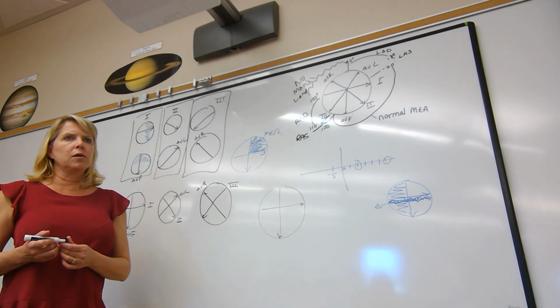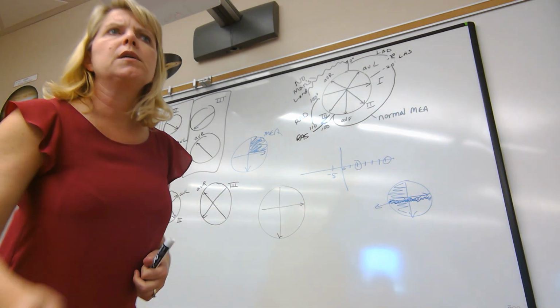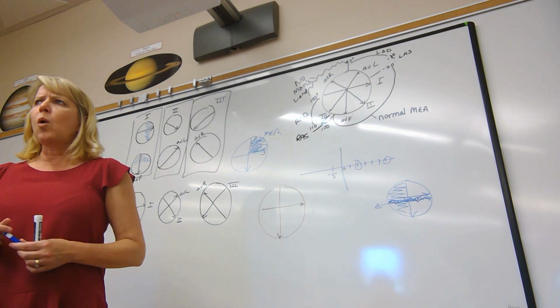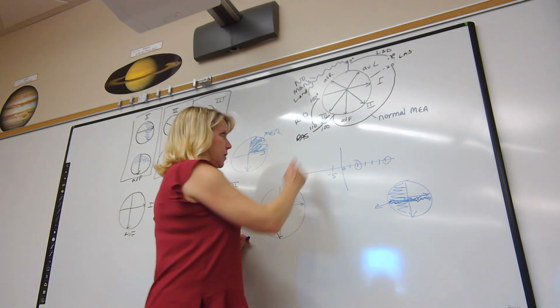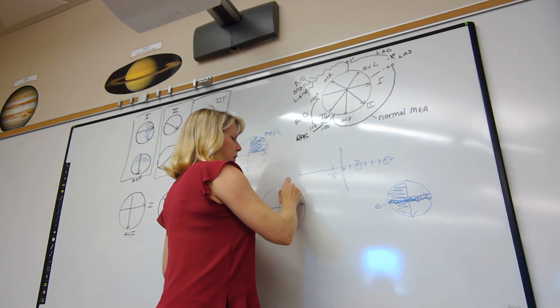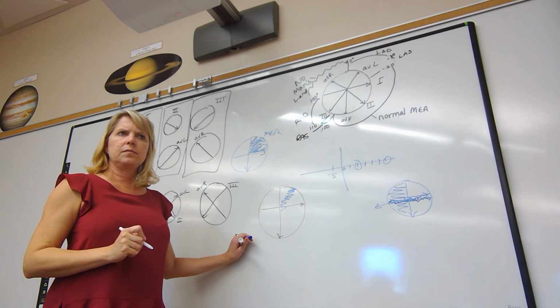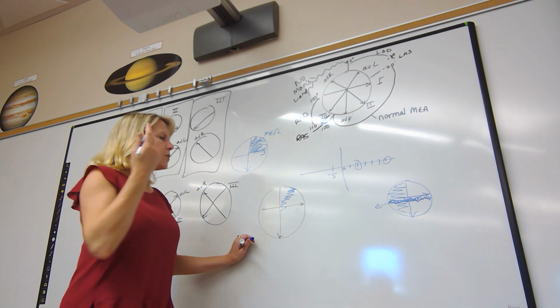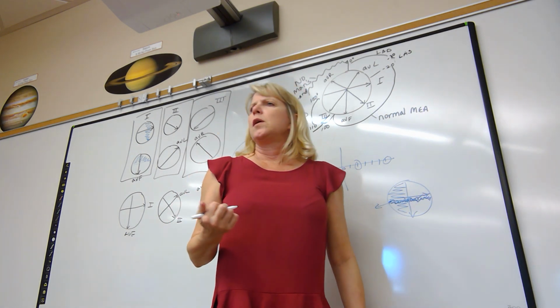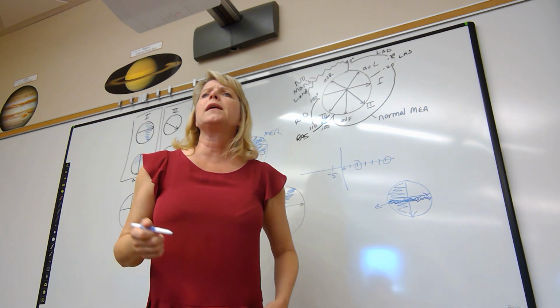If I tell you that the patient has a left axial deviation, I would expect you to know where that MEA would point. Left axial deviation, according to Kara, is somewhere over here-ish. Agreed? Okay? So then I say to you, tell me, lead 1, would it be overall positive or negative deflection?